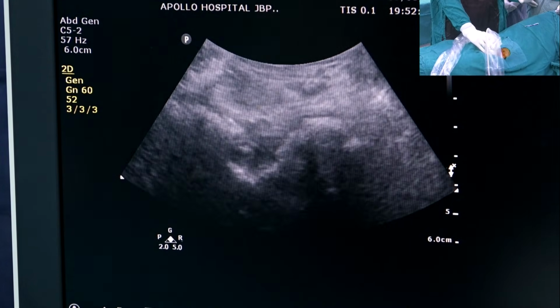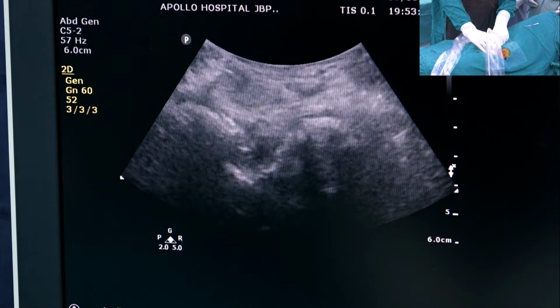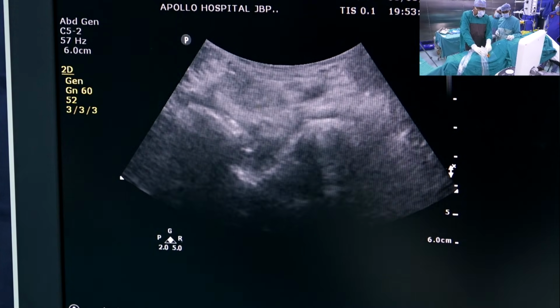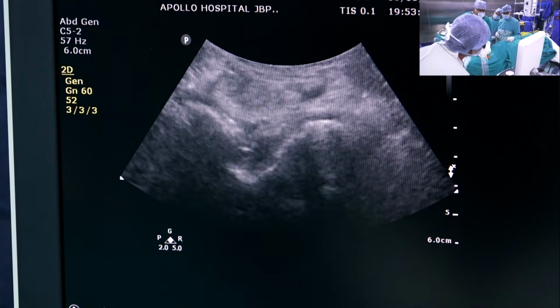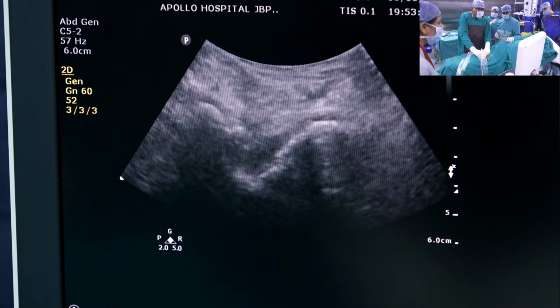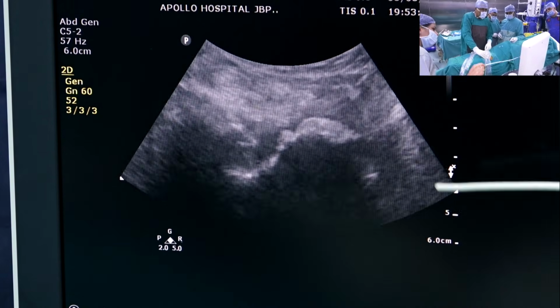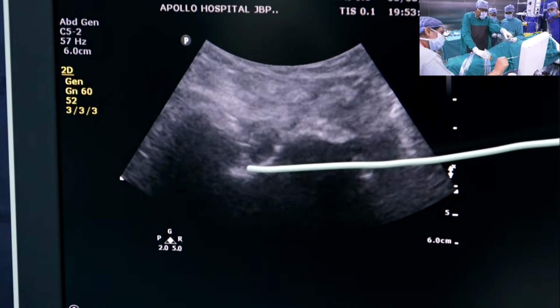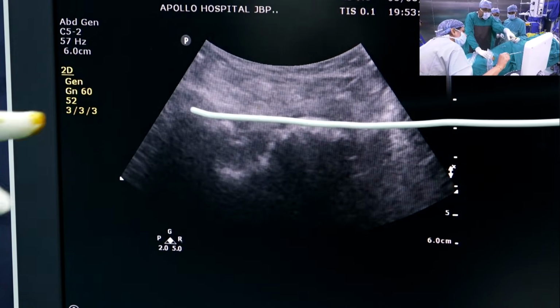Presently, you are not seeing the anterior cruciate. Now, we know that it lodges in the posterior part of the lateral condyle. So this is the lateral condyle where I am moving it. Now I am moving my probe slightly counterclockwise. On moving it counterclockwise, I can see deep down the ACL, the attachment on the lateral condyle.